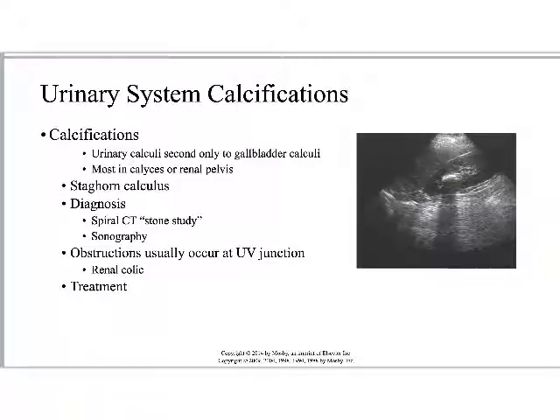Out here is basically just noise. I can't hear anything out here. Up here I definitely hear this, and it's not only so noisy that it's creating this strong signal, I also can't hear anything behind it. So I know that that's definitely calcium or calcified or somehow hard. So this is showing me a lot. It's showing me, number one, why ultrasound can't do very much with skeletal anatomy. But it's really good at the soft tissue stuff, particularly if it's fairly superficial to the surface of the body. So for calcifications, ultrasound is a great first line of defense.